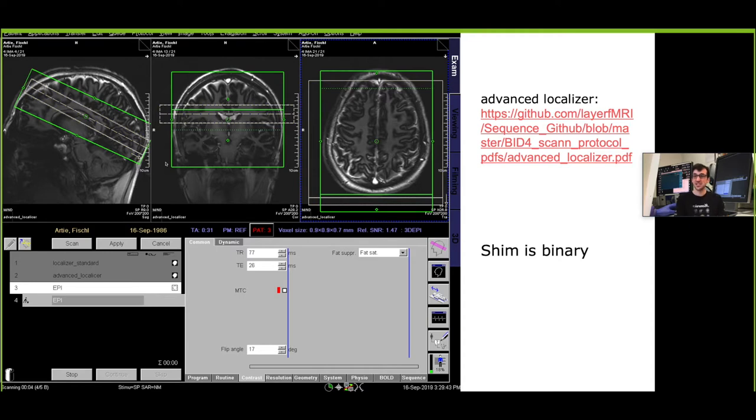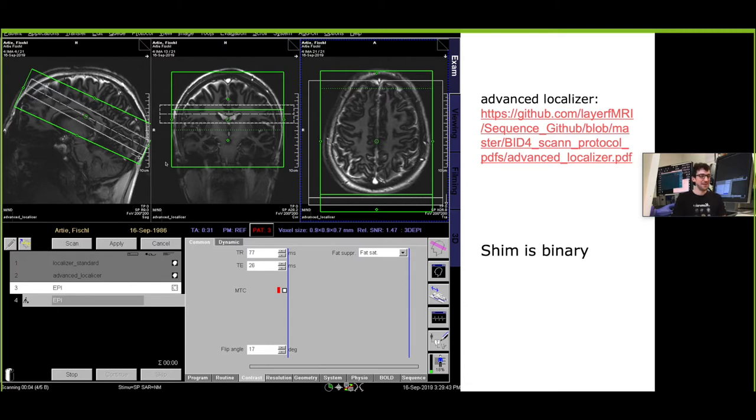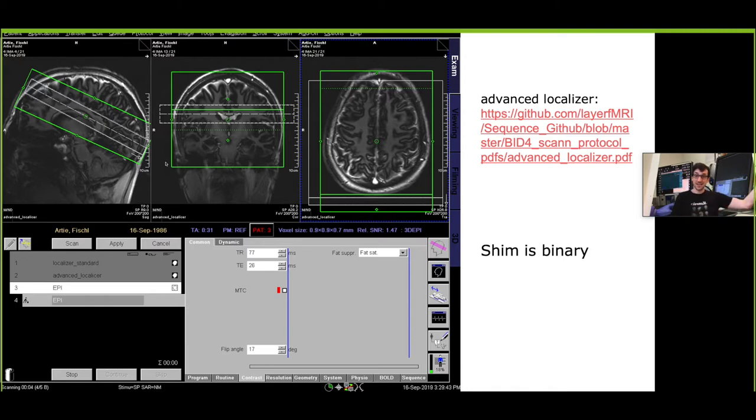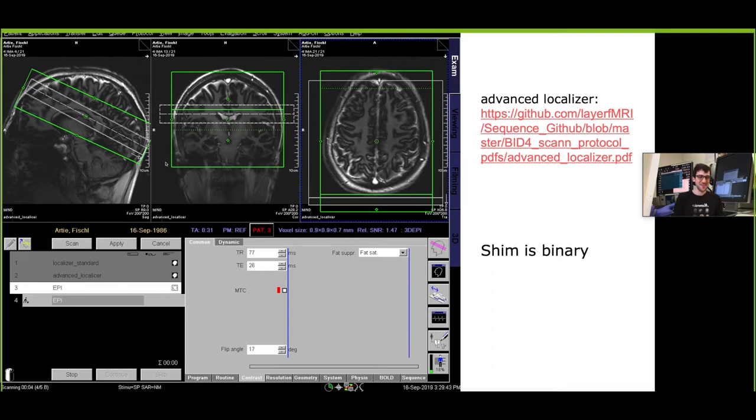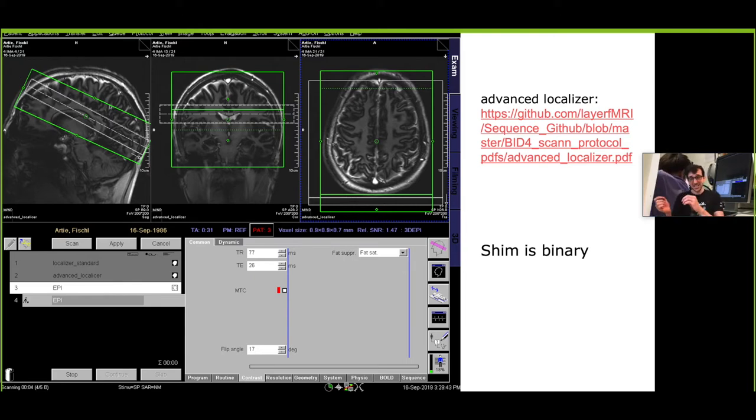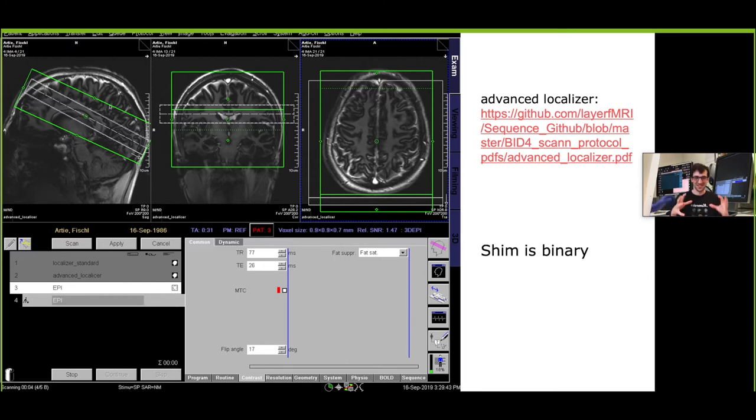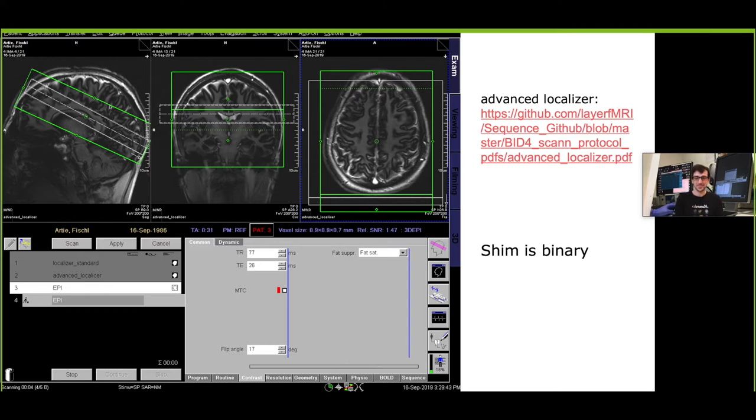The next thing then would be shimming and I guess shimming is still somewhat a black box in the sense that all the knowledge and expertise and tools that are described in the academic literature did not really find their way yet into the very user friendly applications on the vendor side. So we usually deal with a kind of binary shim meaning that voxel is either inside the shim box or outside the shim box. There's no weighting or ROI hotspot where you really want to optimize it.